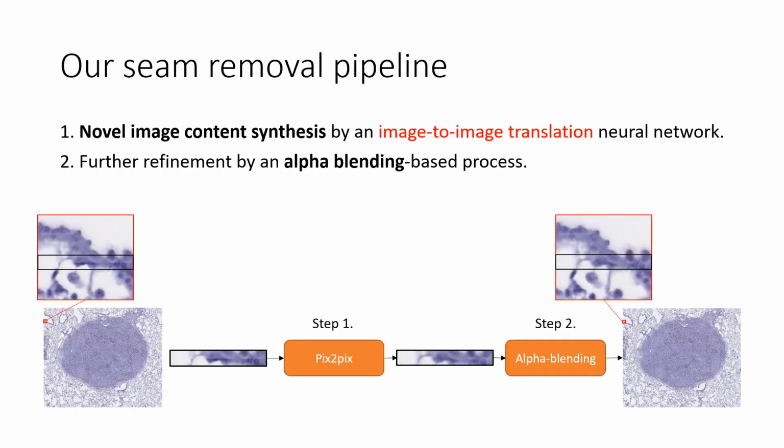We tried traditional image blending methods to remove the seams, but they were not able to satisfactorily remove them. Therefore, we propose a novel two-step pipeline to remove the seams specifically. In the first step, we leverage a neural network to synthesize novel contents to replace the regions at the patch boundaries. We use the Pix2Pix neural network and found it works quite well. In the second step, we further refine the results by an alpha blending process.